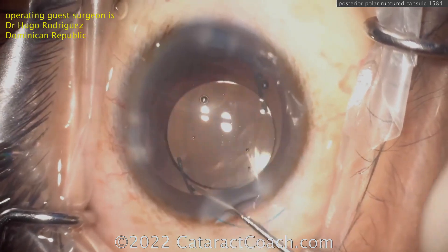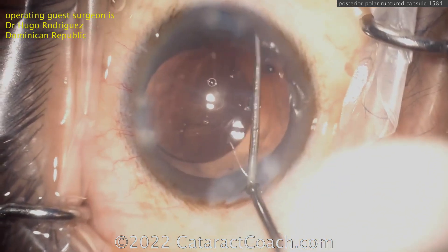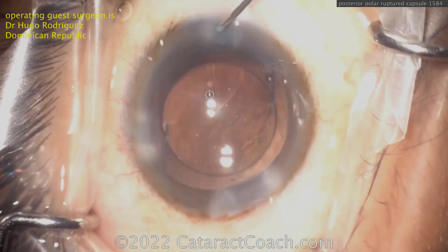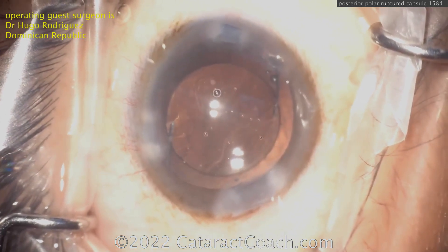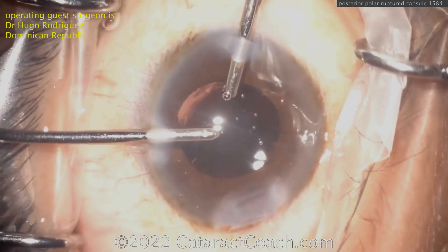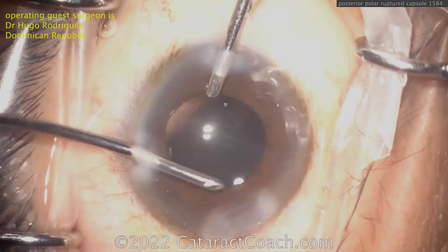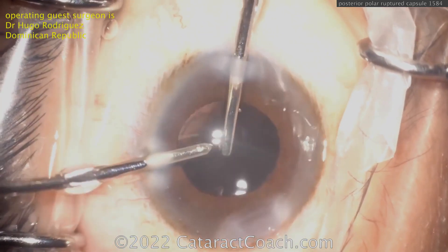I want to show you that even fantastic surgeons like Dr. Rodriguez can have a case like this because of patient tissue. Get the haptics in the sulcus, get the optic captured, and patients are going to have a beautiful outcome. Posterior polar — remember, the textbook says one out of three can have this complication, but in practice you can get that number far lower. Remember to explain to your patients that it's not just your master technique — it's also their actual patient tissues and healing.